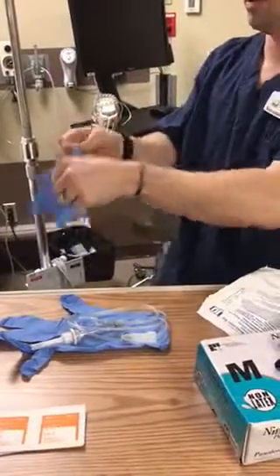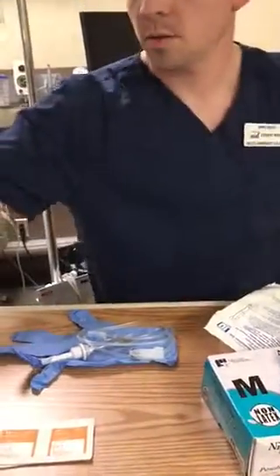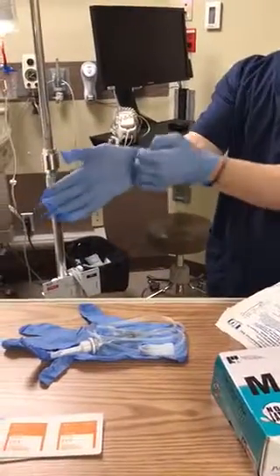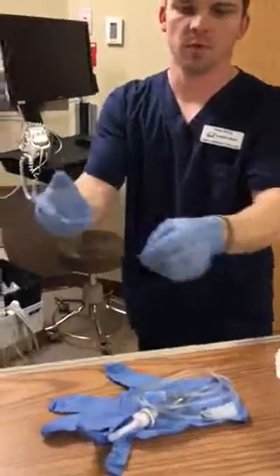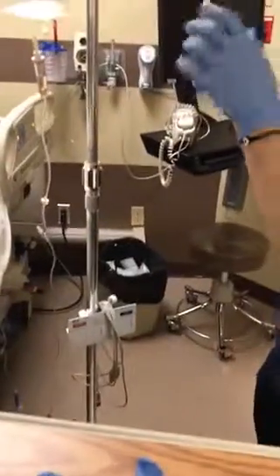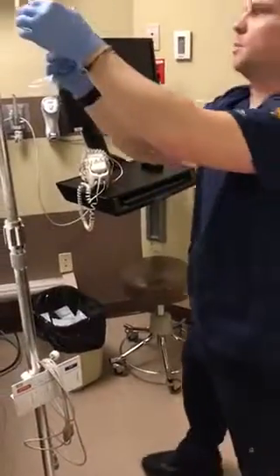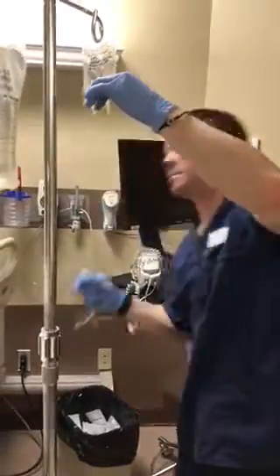Put clean gloves on for putting in the administration set. All right. The roller clamp. I'm going to, makes a very satisfying noise.